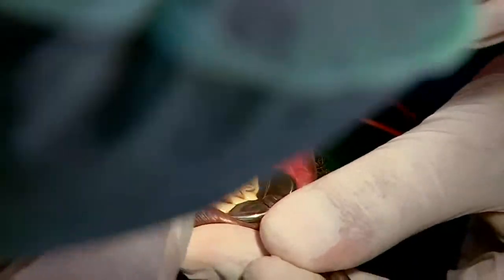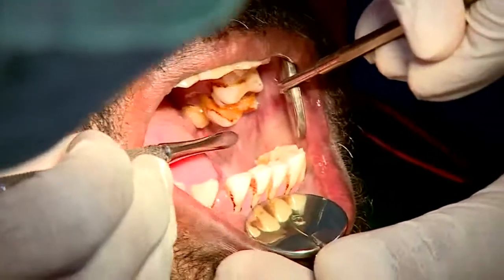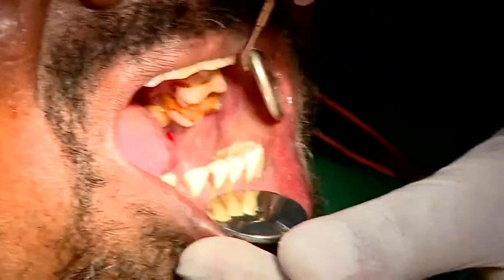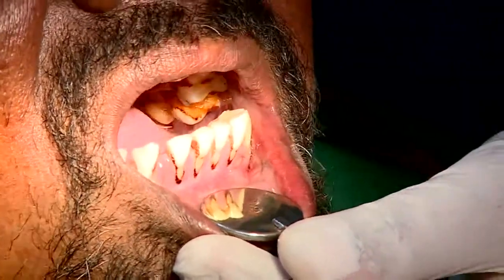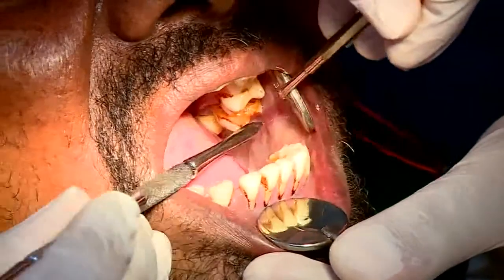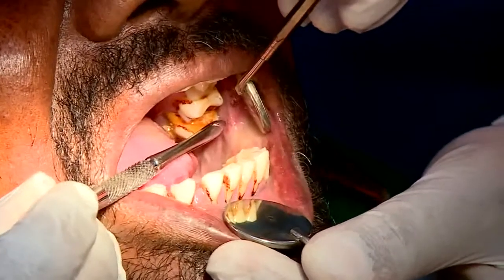Okay, to start with the biopsy, here we could see there is a small erythematous change happening in this area, and that's the fibrous band. Could you see me feeling the fibrous band in that area? Yeah, we are able to see it. Okay, so that's the area of interest.